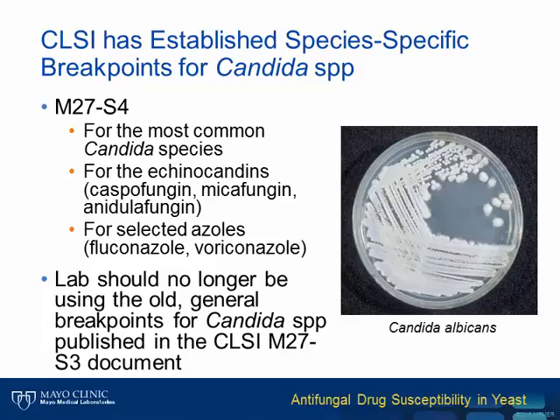In the earliest versions of the Clinical and Laboratory Standards Institute approved standard for broth dilution antifungal susceptibility testing of yeast, there was a single table listing the breakpoints and interpretive criteria for all Candida species. Since that time, it is recognized that various species of Candida respond differently to antifungals, and therefore species-specific breakpoints have been established and published in the latest version of the document.